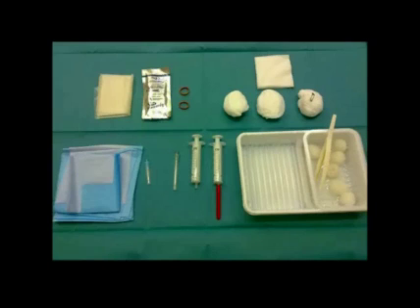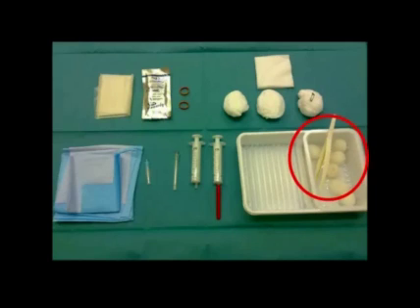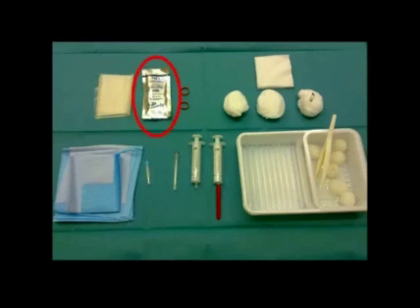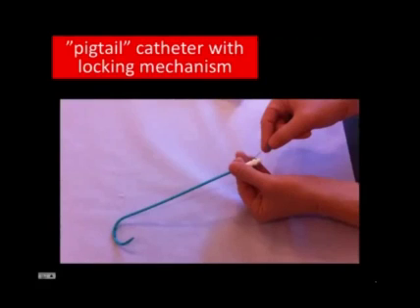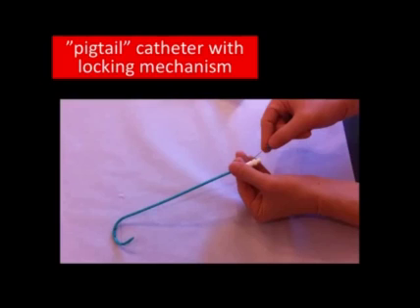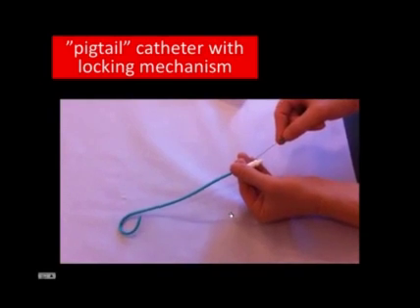The procedure should be strictly sterile. On the surgical table should be prepared beforehand swabs and disinfectants such as chlorhexidine, sterile drapes, a sterile transducer cover with rubber bands to keep it in place, sterile ultrasound gel, syringes and needles, and a surgical blade for skin incision. The star of the procedure is the pigtail catheter — a catheter which features a removable rigid internal metallic second lumen and a coiled end. The most important feature is the locking wire, which locks the coil and prevents catheter dislodgement.